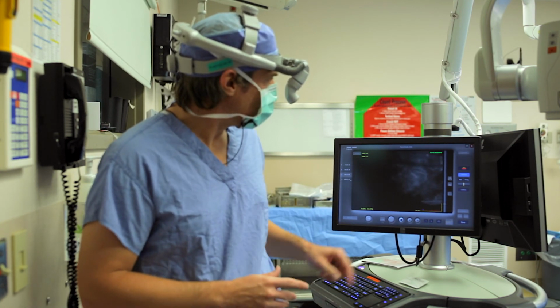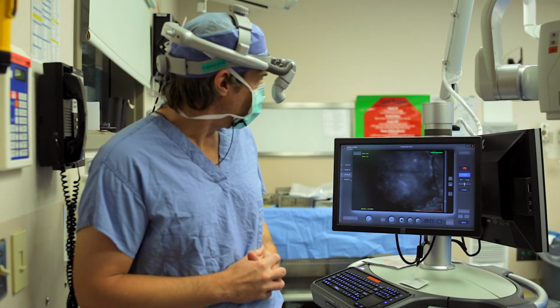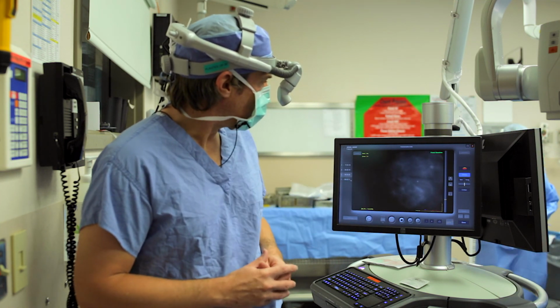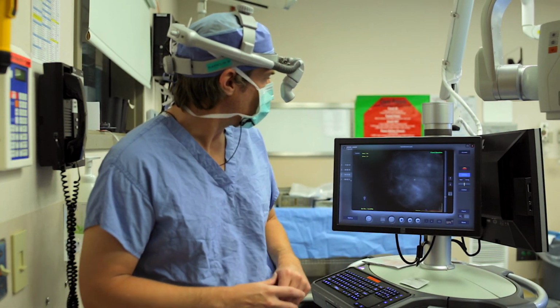And now we're looking at the right abdominal flap. Excellent perfusion here. We can see that scar coming across in the mid portion of the flap, and you can see the corners of the flap out laterally. The perfusion, or the brightness of the white, isn't as good. I'm going to hit pause right there for a second.